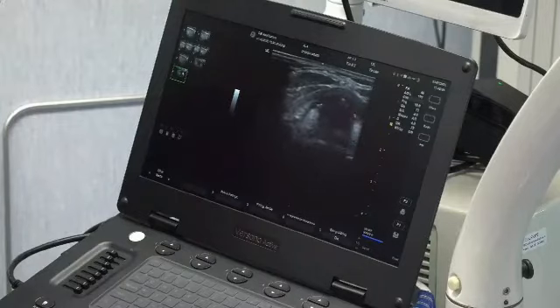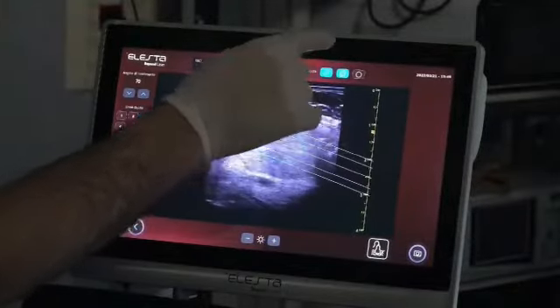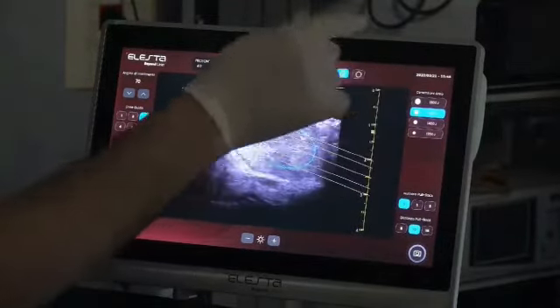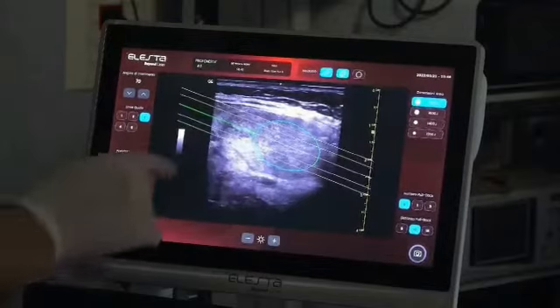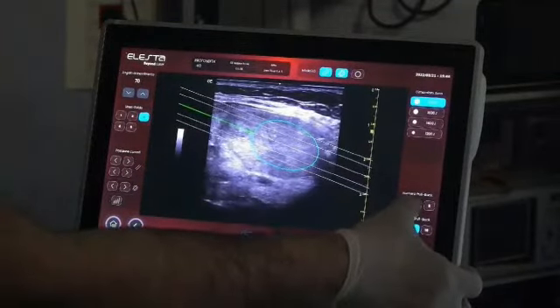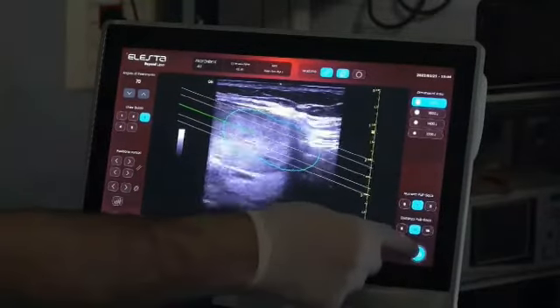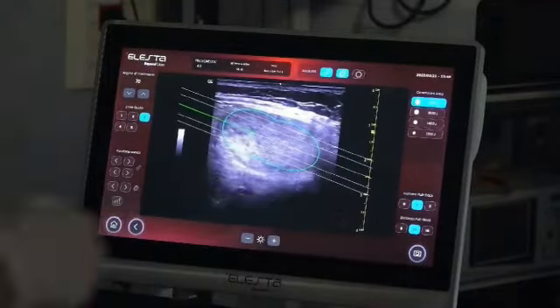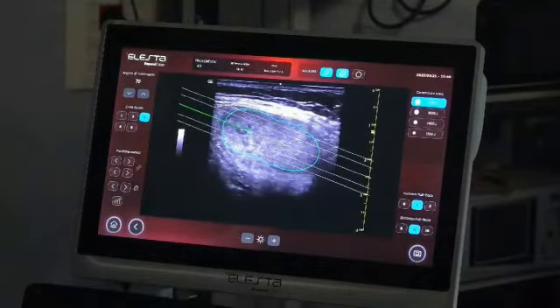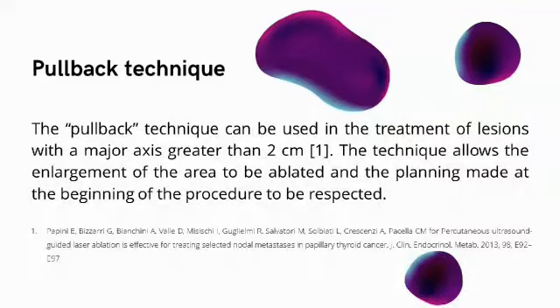The treatment is planned. The probe is placed longitudinally. The planning is activated where the 5 lines that correspond to the 5 accesses of the guide needle are shown. The energy to be supplied is chosen, which varies from 1200 to 1800 joules for each lighting of the fibre. As in this case, the pullback is planned, which varies from 0.5 cm to 1.5 cm.